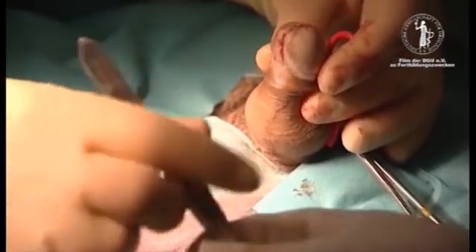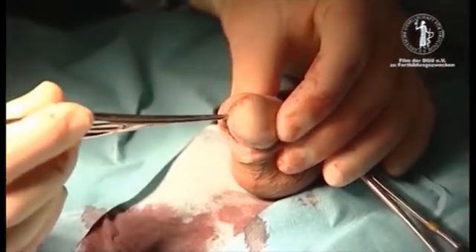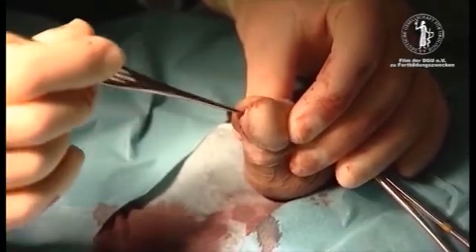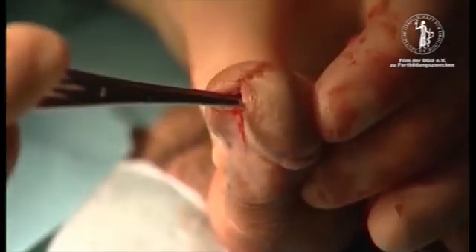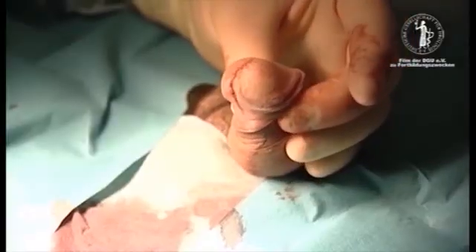Here you can see a normally shaped glans penis now, and the meatus is wide open with a really good slit meatus at the tip of the penis. The operation is over.